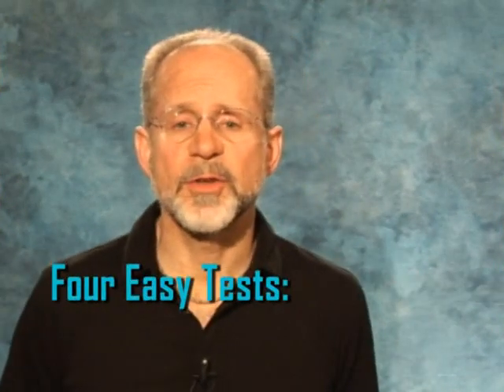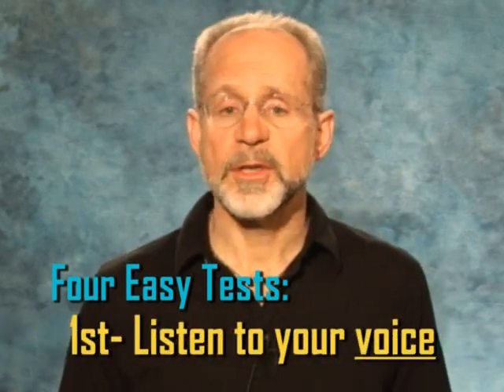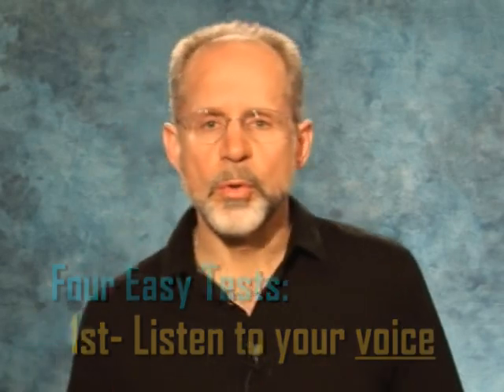There are 4 easy tests to check the fit of your earplugs to let you know if refitting is needed. The first is to listen to your own voice. Say the words boom, beat, and pay attention to the sound of your voice. With a properly fitted earplug, you will create an occlusion effect that changes the sound of your voice as heard by you. This will make your words seem boomy, resonant, hollow, more full, or we might say bassy. You will have noticed that in the soundtrack we have mimicked that effect by changing the sound quality. If you don't hear this boominess in your own voice, then try refitting the earplug.